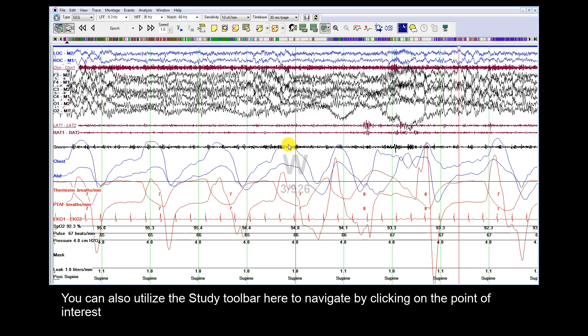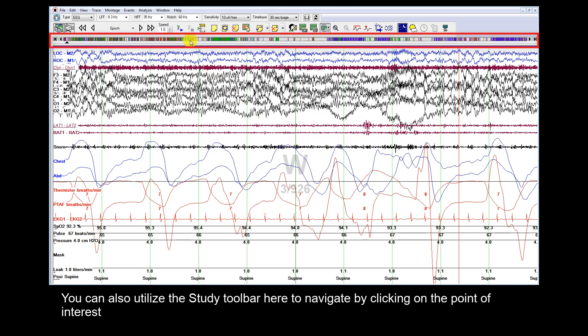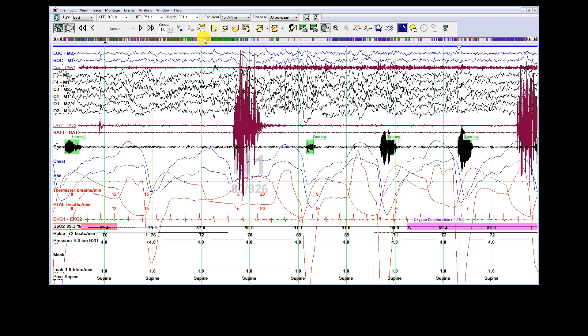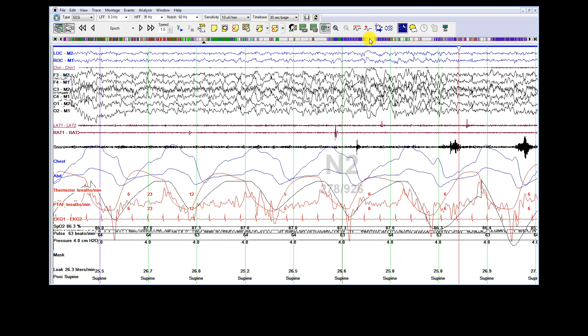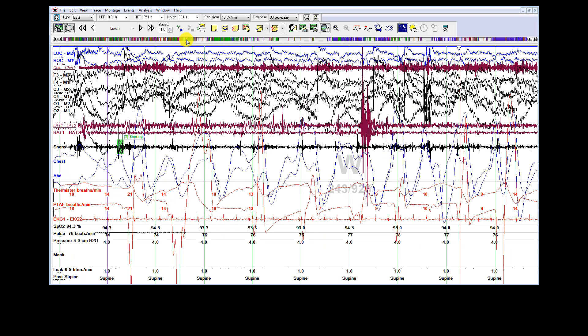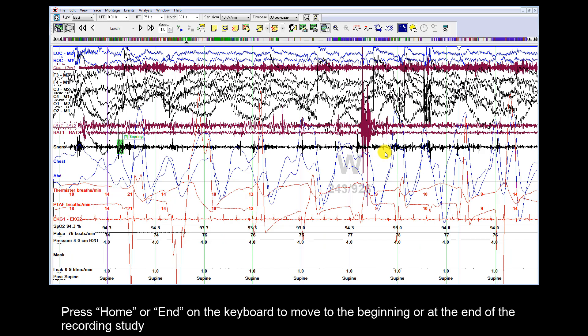You can also utilize the study toolbar here to navigate by clicking on the point of interest. Press Home or End on the keyboard to move to the beginning or the end of the recording study.